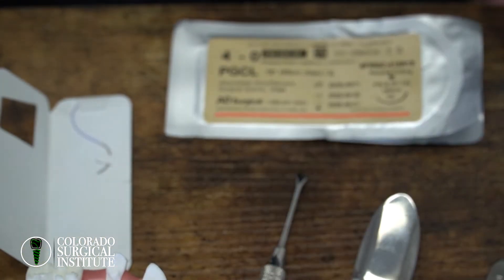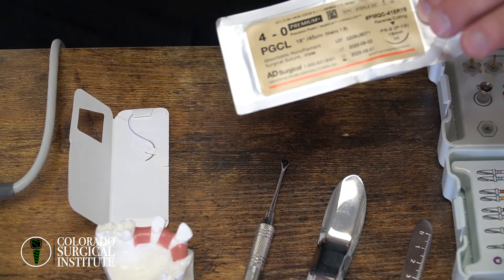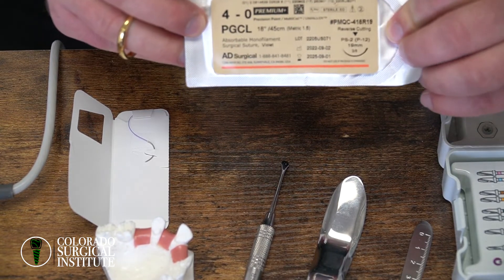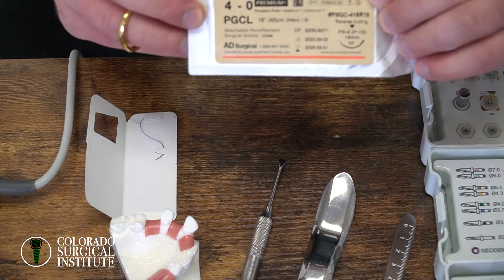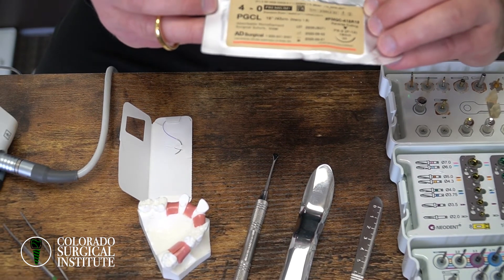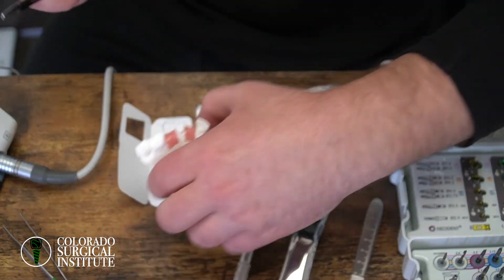Some of the sutures that we like to use: one is PGCL — I get this from AD Surgical. I like it because it's a little bit stretchy and it is resorbable. My other suture that I use very commonly is PTFE, also 4.0. For PTFE, I usually get a 13 millimeter needle. For PGCL, I usually get a little bit bigger, usually the 16 or 19 millimeter needle.